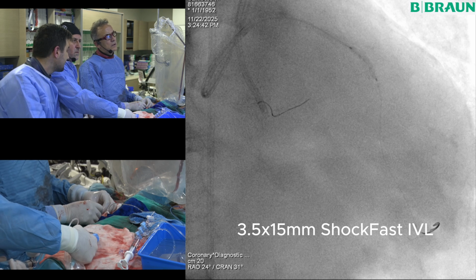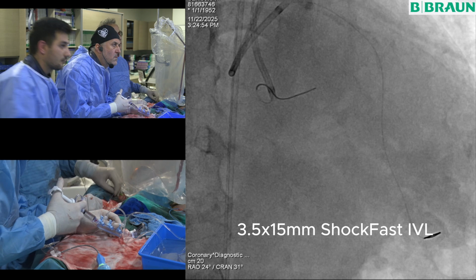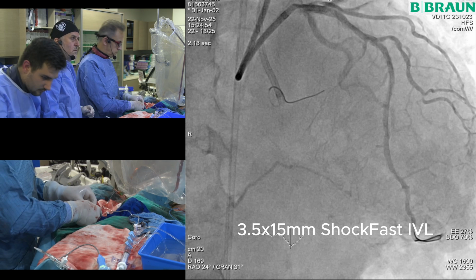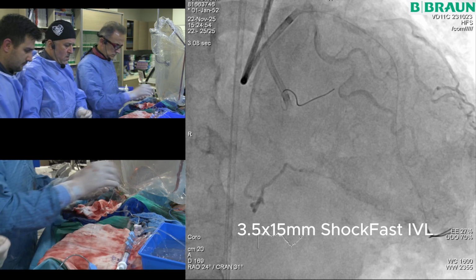Are the numbers the same there? I've got no idea. But ultimately, when you get to a point about a pressure wire, I think that's the right place to go here. The only caveat, and you're going to tell the audience in a moment, John, is how do we interpret a pressure wire with an occluded right coronary?